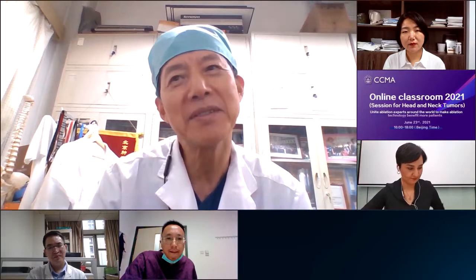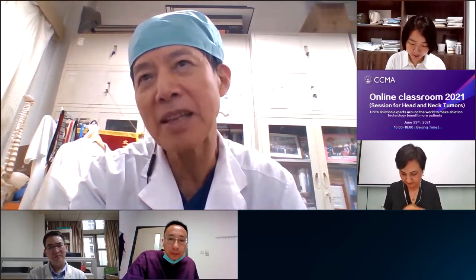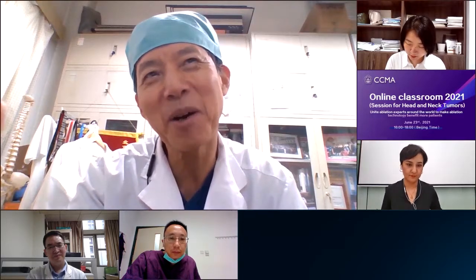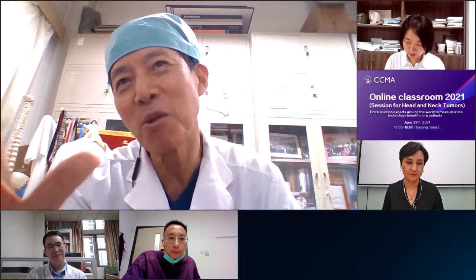Just now, some doctors gave us their opinion about 1 month, 3 months, half year, 1 year, doing ultrasound examination to see whether the tumors become smaller, shrink or disappear. So that means the follow-up interval, please.